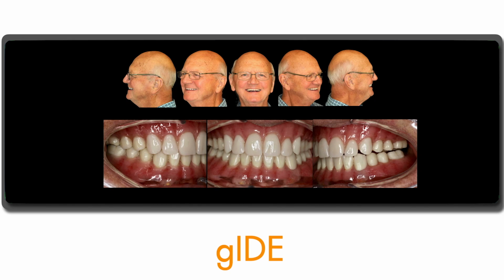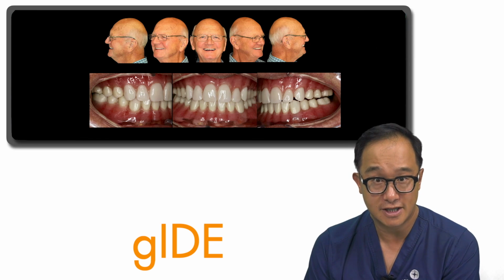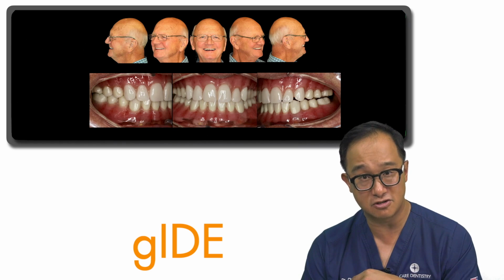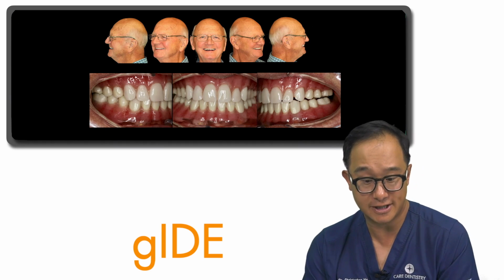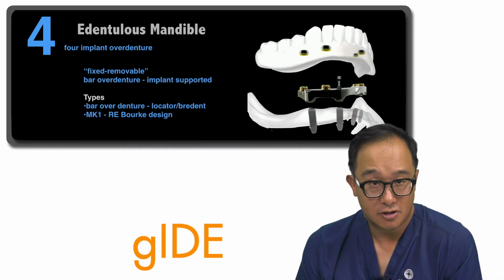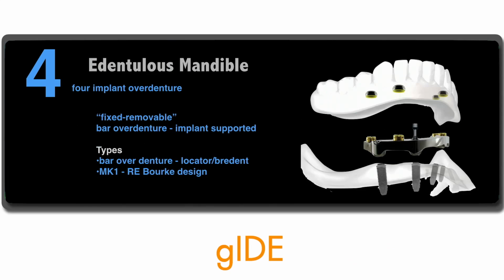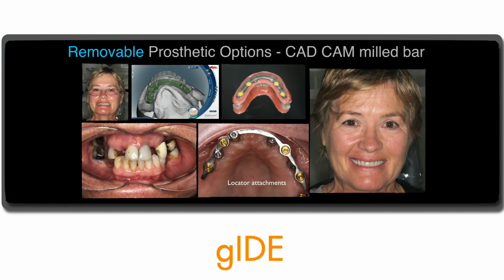And you can see what's really important is the design of your new prosthesis and being able to engage those attachments correctly. Now the tissue support is much better, and the occlusion is a lot improved by engaging more in the posterior teeth rather than, in this case with combination syndrome, having the occlusion more anteriorly. So we looked at the 2-implant overdenture. What about the 4-implant overdenture? We sometimes call this a bar overdenture, a fixed removable solution. Let's have a look at some of these examples.